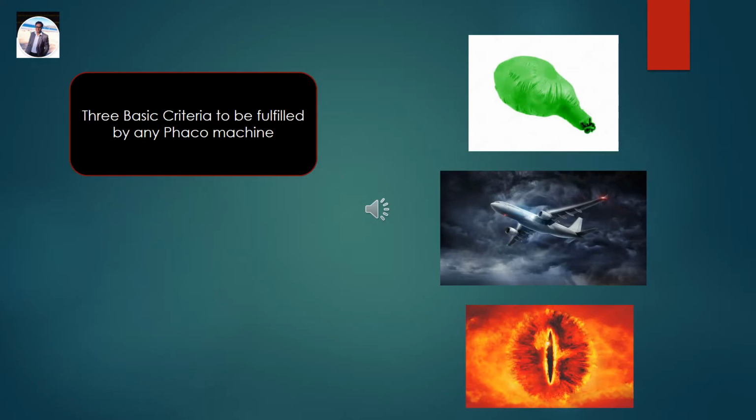So friends, what is the purpose of phaco? Why did we move from ECCE to SICS to phaco? The very objective of phacoemulsification is to give a faster and better visual recovery to the patient, so that the patient can go back to his work quicker.